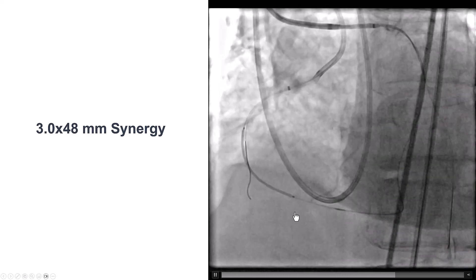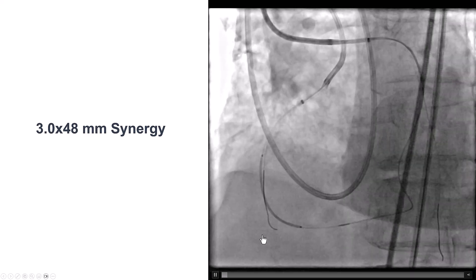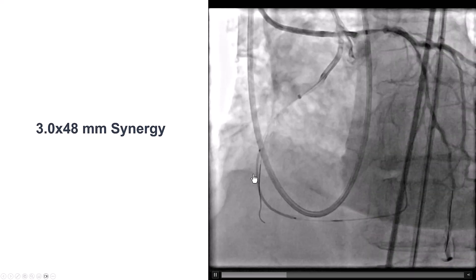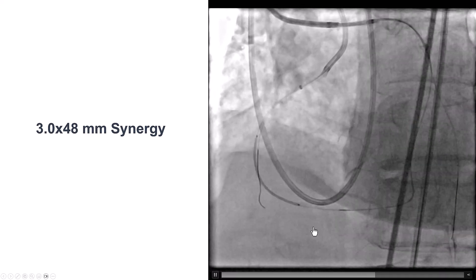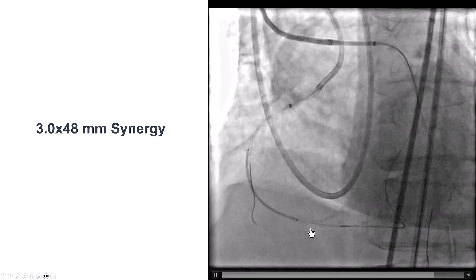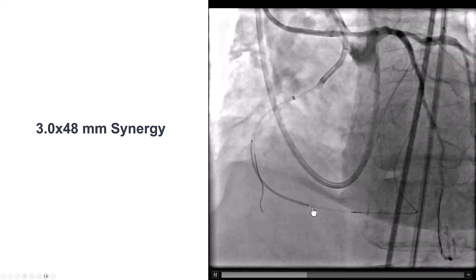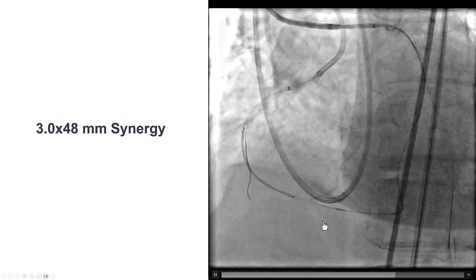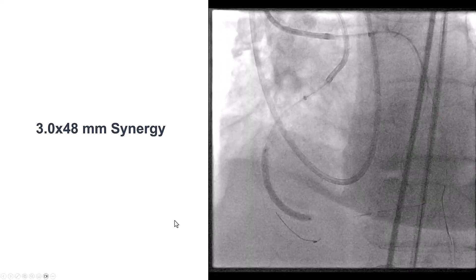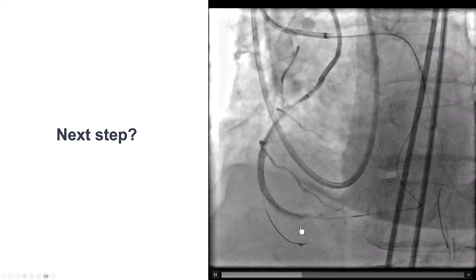IVUS demonstrated we were extraplaque for only a short segment of the vessel. We placed a long 3.0 by 48 mm synergy drug-eluting stent, trying to park it proximal to the distal touchdown. We did a few injections to confirm the location was favorable, then deployed the stent.